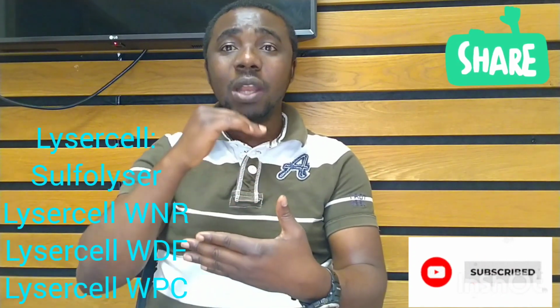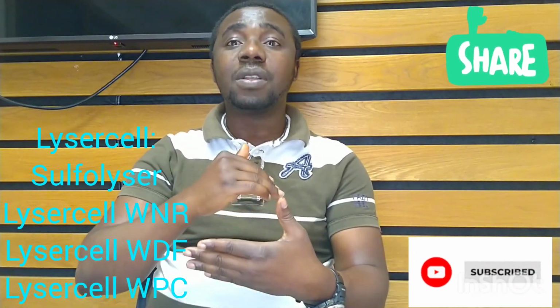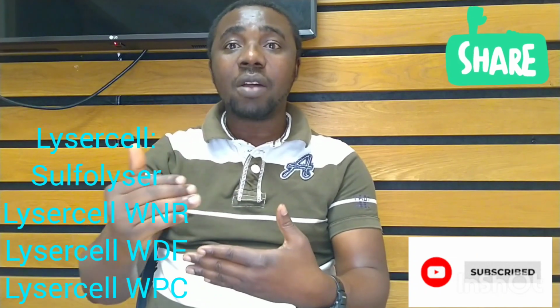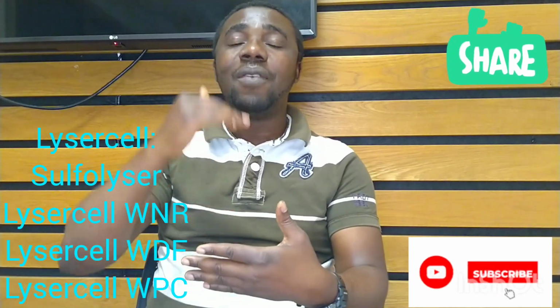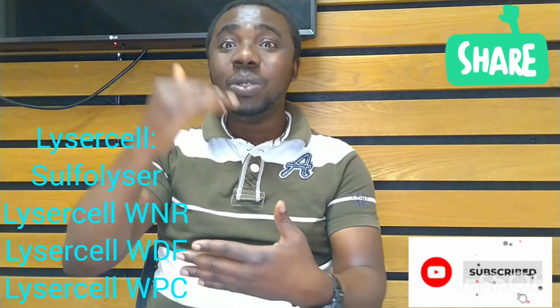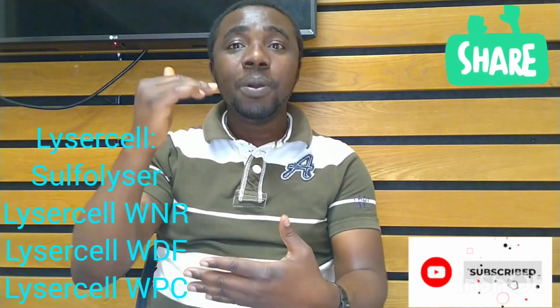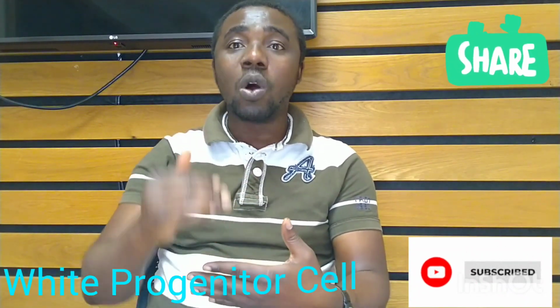Number one, under Lysercell, you can have something like Sulfolyser. Then you can have Lysercell WNR. When you hear the letter W, it means white cell. NR talks about nucleated red cell. Okay, I'll take it again. You have Sulfolyser, Lysercell WNR, and Lysercell WDF. Again, white cells, DF means differential. Then you have Lysercell WPC. WPC means white progenitor cells.